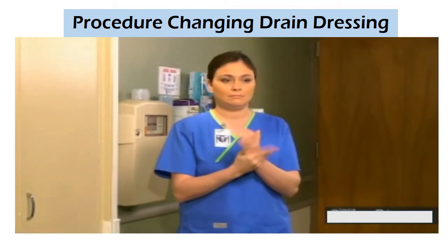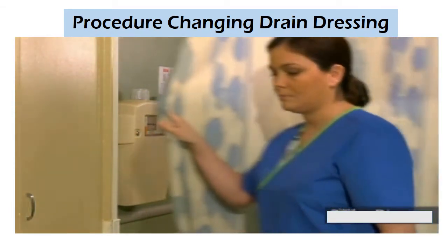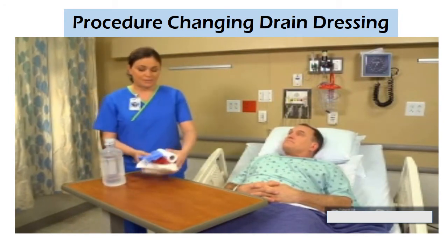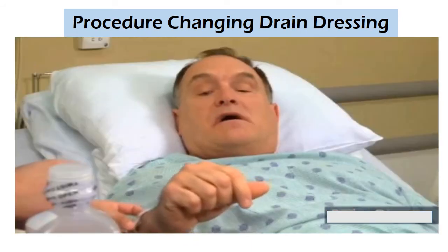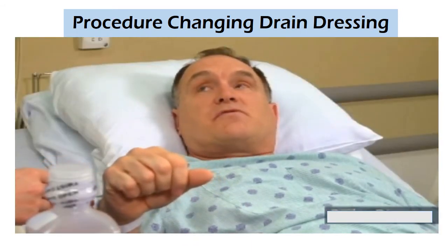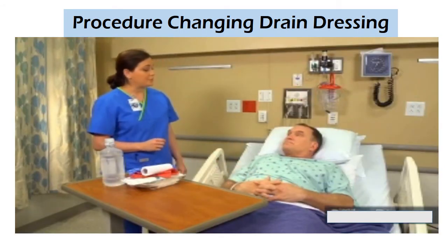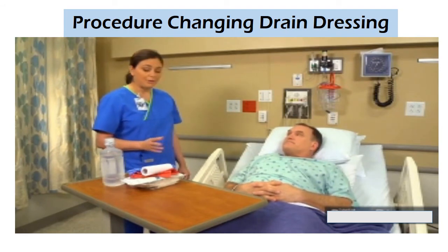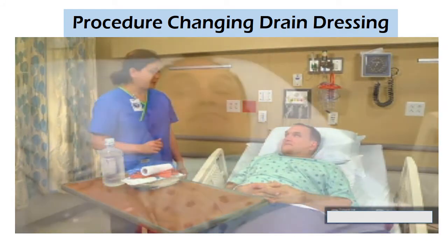Before changing a dressing, perform hand hygiene and ensure the patient's privacy. Introduce yourself. Verify the patient's identity using 2 identifiers. Can you tell me your name? Gary Fulton. Okay. And your birth date? 6/14/1954. Okay. As you explain the dressing change process to the patient, assess his pain level. Check that the prescribed analgesic administered 30 minutes prior has taken effect.